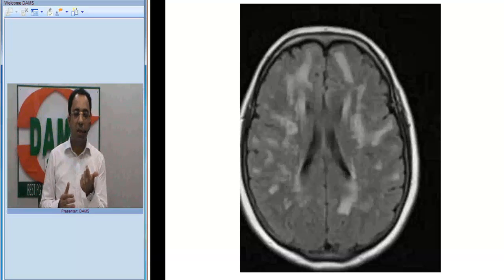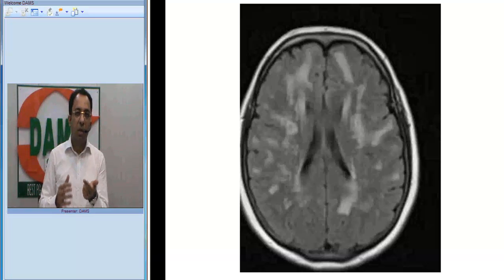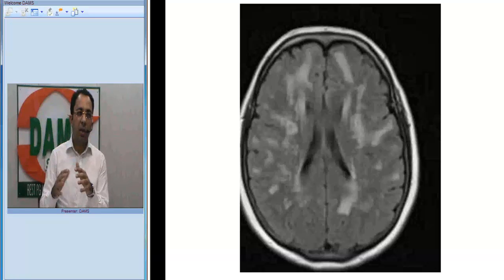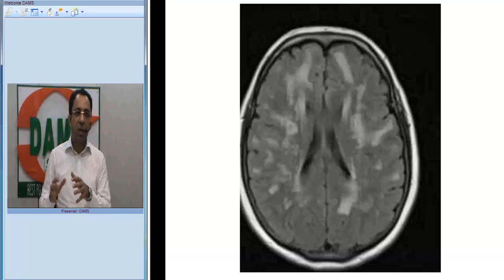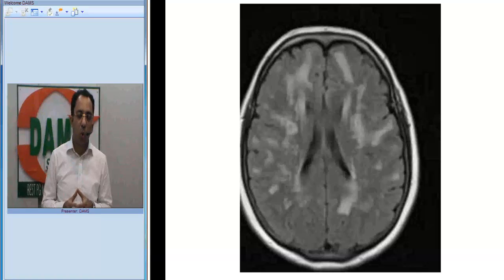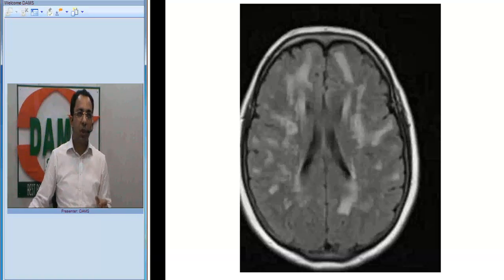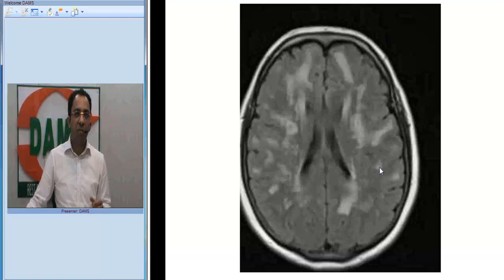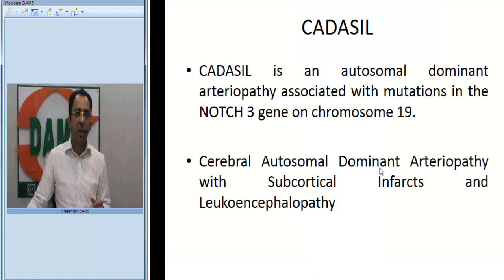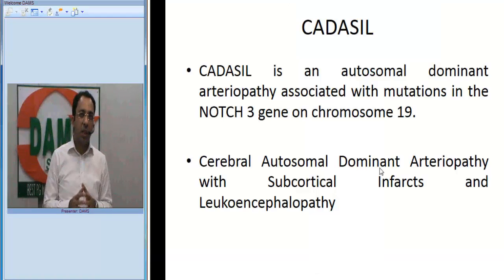With the clinical scenario of headache, recurrent TIAs, strong family history of stroke, and a relatively young age between 30 to 50, combined with these MRI findings of anterior temporal lobe and external capsule involvement, we arrive at a diagnosis of CADASIL.